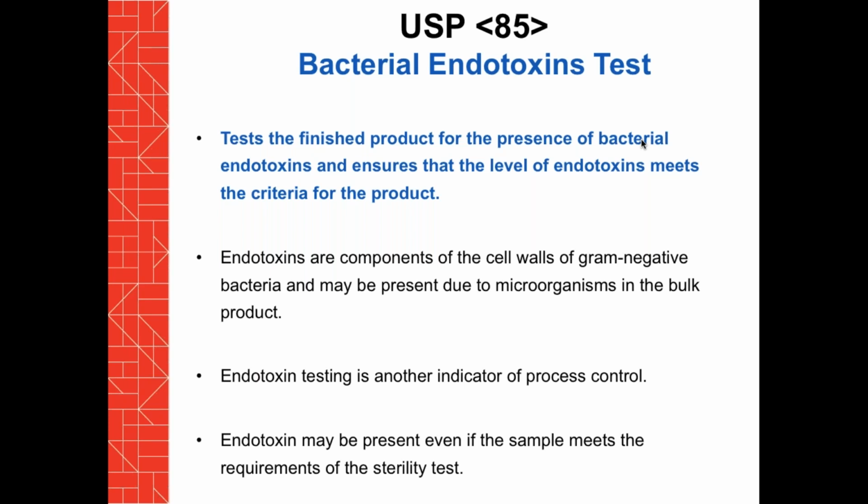Endotoxins are byproducts of gram-negative bacteria when the cells die, and therefore they have the potential to be present in sterile and non-sterile drug products that are or have been contaminated with gram-negative bacteria.